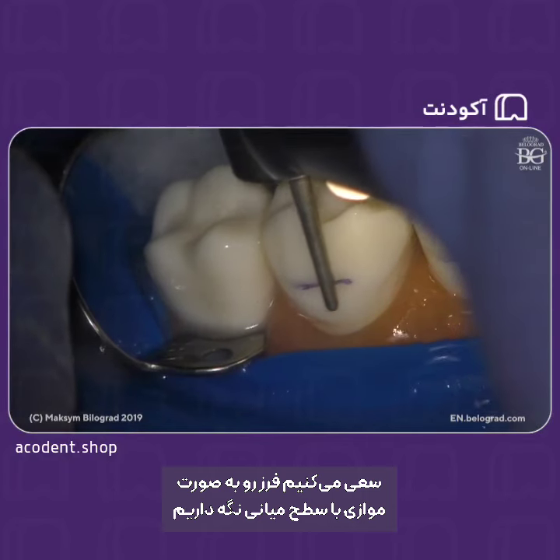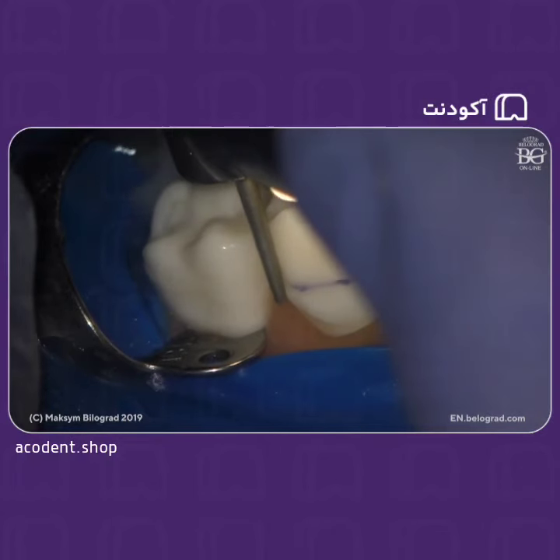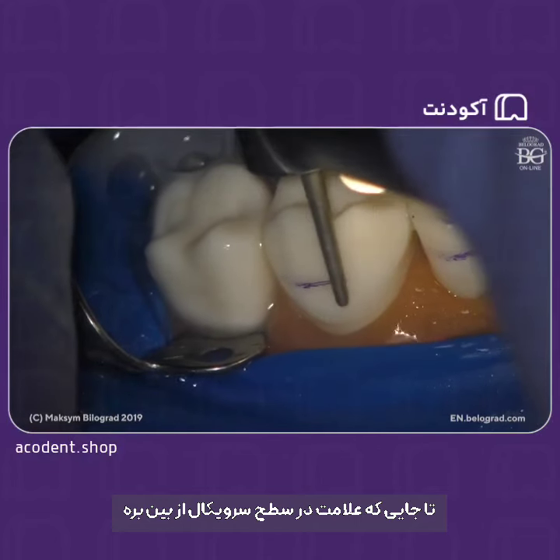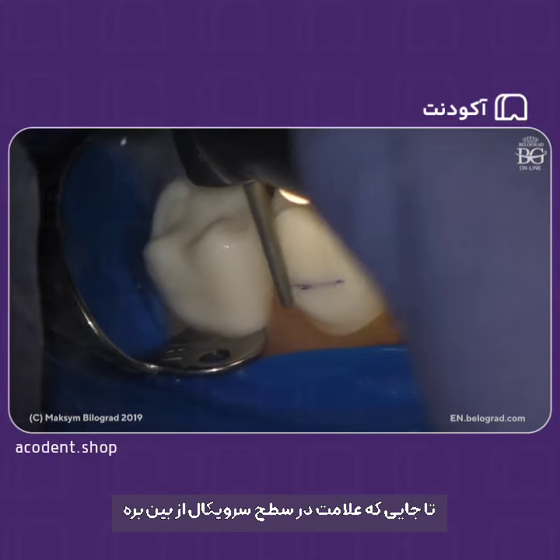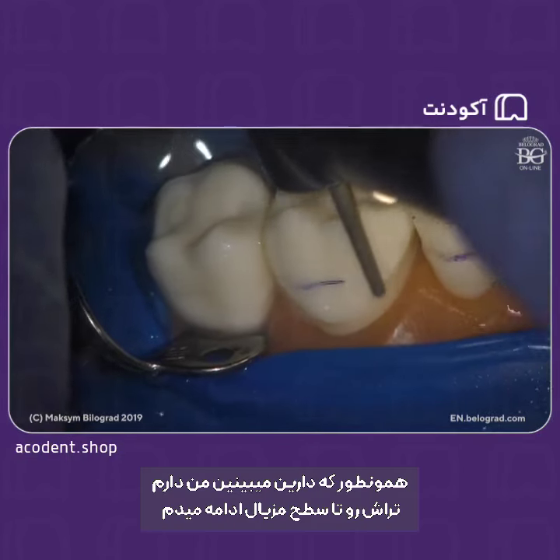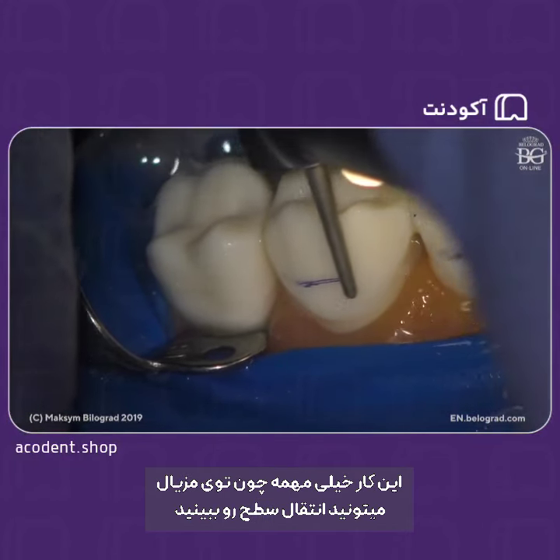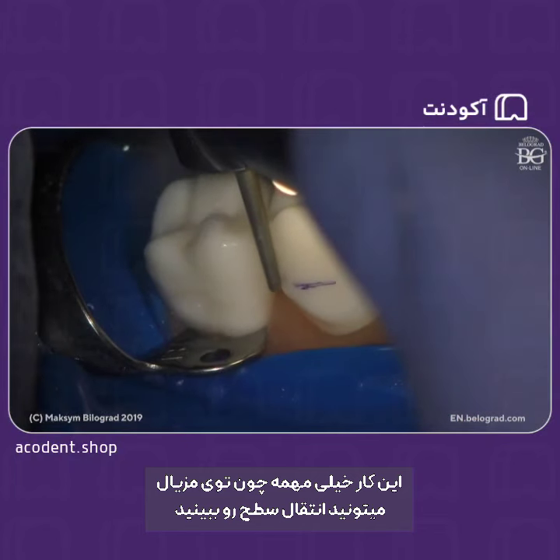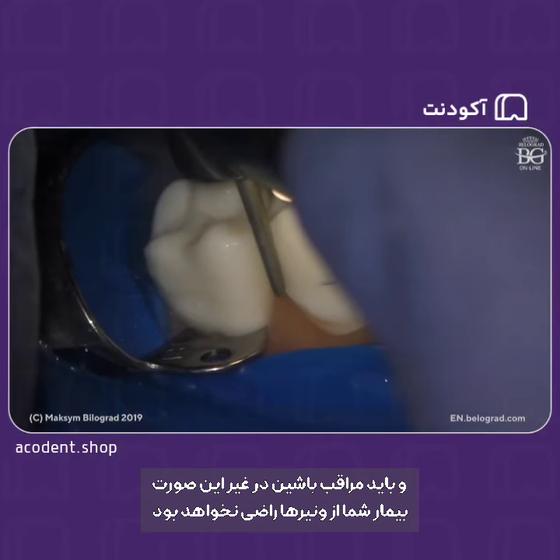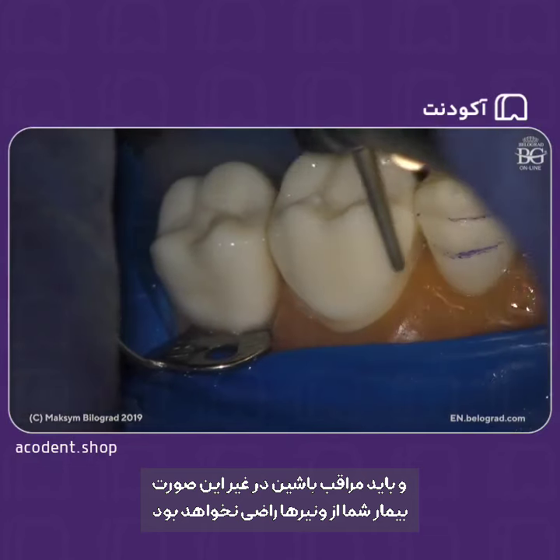Okay, we keep our burr parallel to the middle plane until we lose that mark in the cervical area. And also see that I'm making a prolongation to the mesial part of the tooth. This is important because mesially you can see the transition, so you have to be careful in that regard. Otherwise, your patient will not be happy with your veneer case.